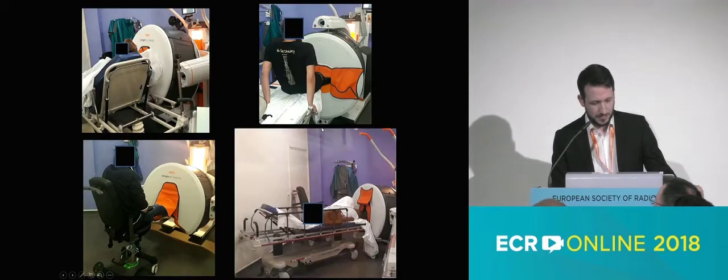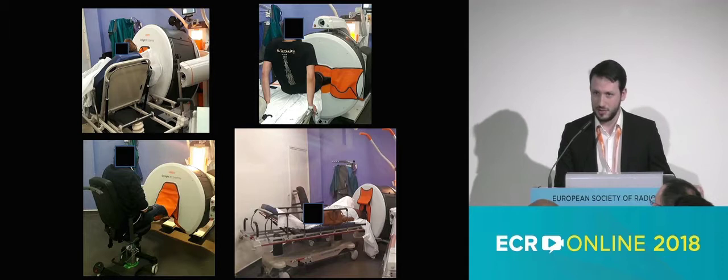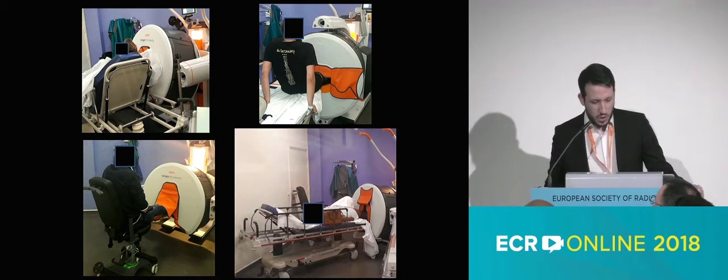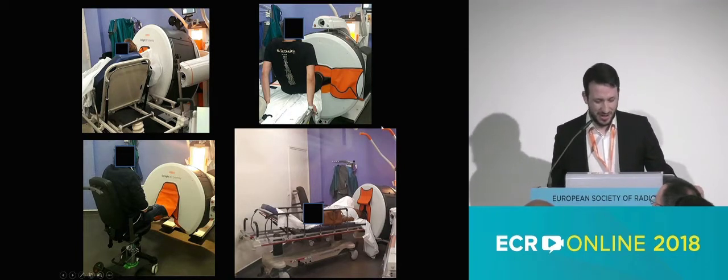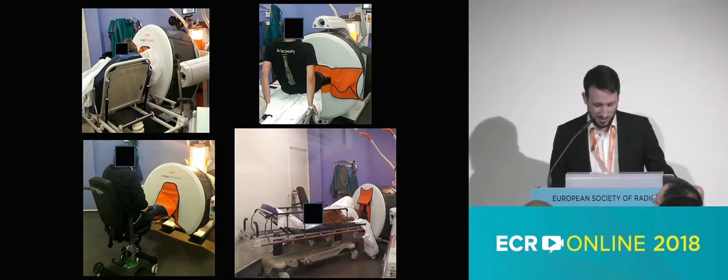One of the first things I heard when we decided to put the device in the ER division was that maybe ER patients are not the easiest ones, because they are in pain, they're going to move, you're going to have old patients, and so it may not be a good idea. But in the end, we succeeded in about every situation. Even the patients who are lying on beds, we tried and succeeded. It may not be very conventional, but in the end, we managed to do this.